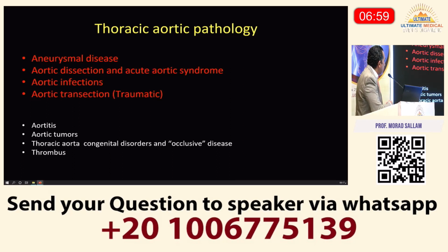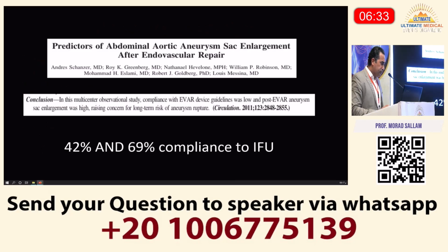This is what we treat. We treat aneurysmal disease, aortic dissection and acute aortic syndrome, aortic infections with mycotic aneurysms, and aortic transection in trauma. We also do treat sometimes aortitis and aortic tumors, thoracic aortic congenital disorders with occlusive disease, and sometimes a shaggy aorta or a thrombus embolizing. You might want to trap that. So multiple usage of a thoracic stent graft.